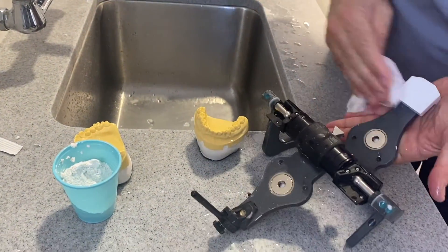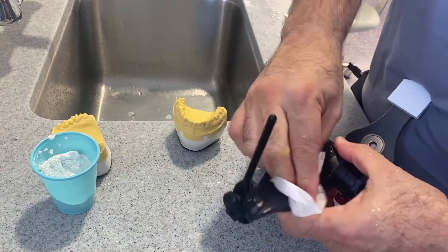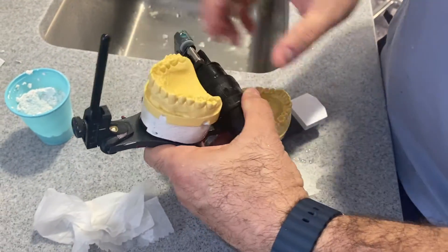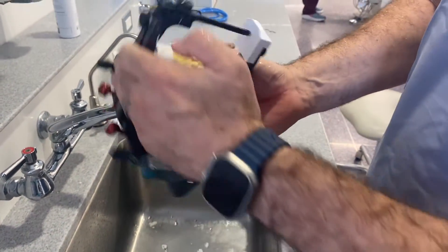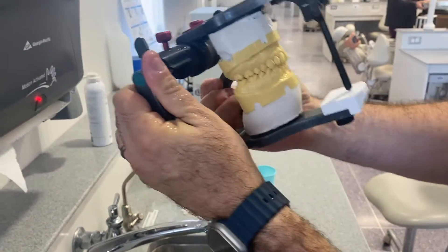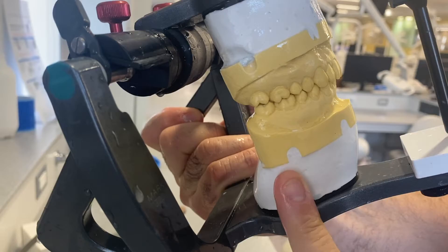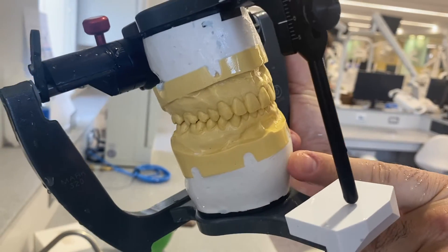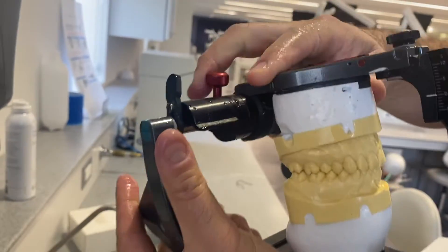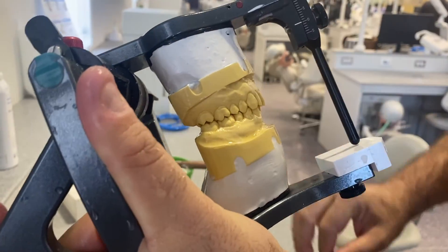After that, make sure you clean your articulator, set up the upper, and make sure it's biting correctly. If the surface is grainy, you can always sand it back again to make it nice and smooth — that's the texture we're looking for, not grainy but smooth. The pin should be at zero and you should have full occlusion everywhere, then you can hand it in.